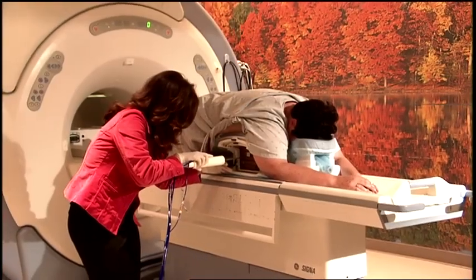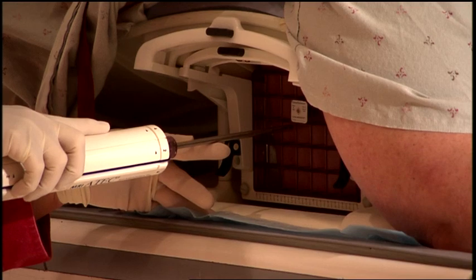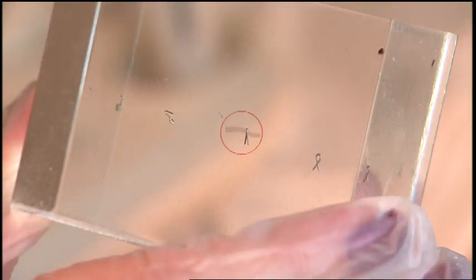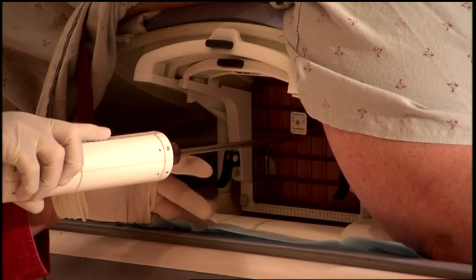The radiologist places a tiny marker in the breast at the biopsy sites so they can be easily identified on a mammogram. The markers are made of titanium and pose little, if any, health or safety risk. Patients often are not even aware of them.